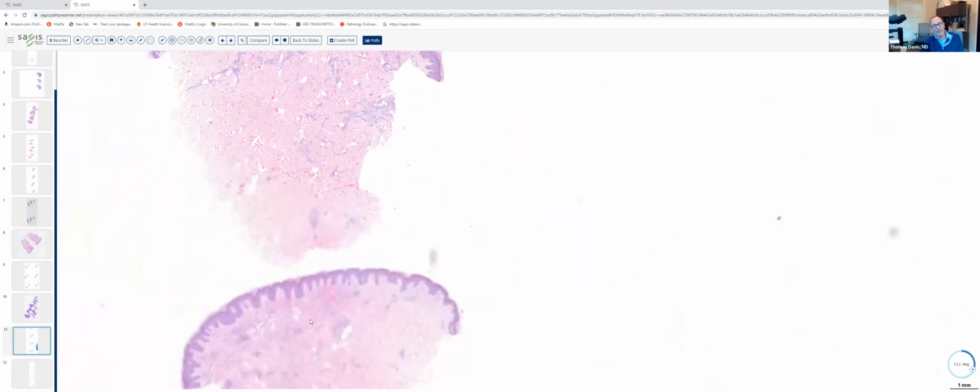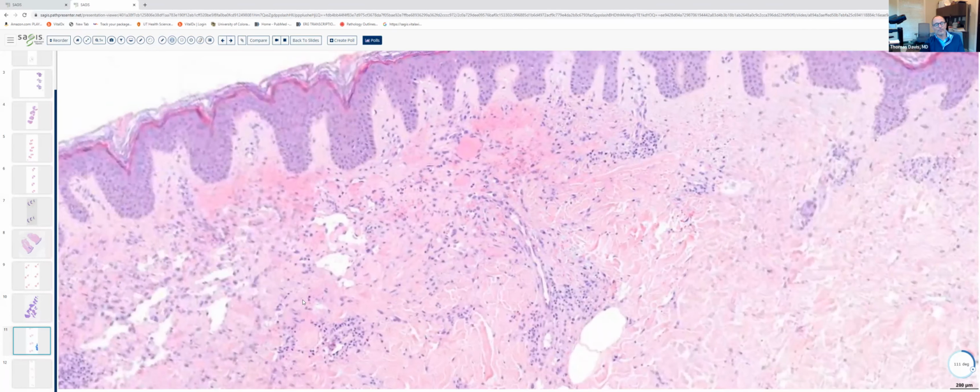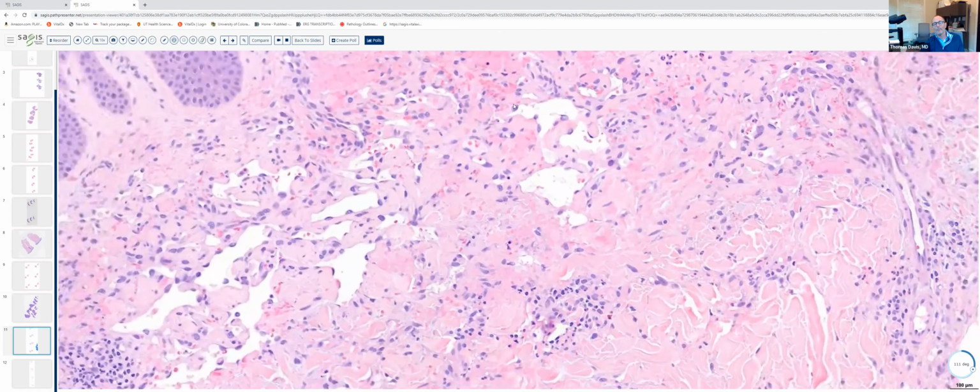So let's look at the bottom piece, which frequently do contain these papillary projections, which protrude into the lumina, these plump endothelial cells, and then at the periphery, more compressed vascular channels, which dissect between collagen bundles. And it's at the periphery one frequently sees extravasated erythrocytes, siderophages, and an infiltrate of lymphocytes.